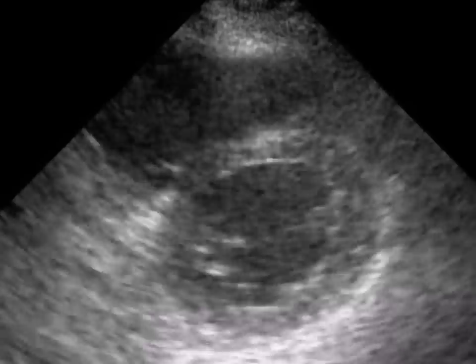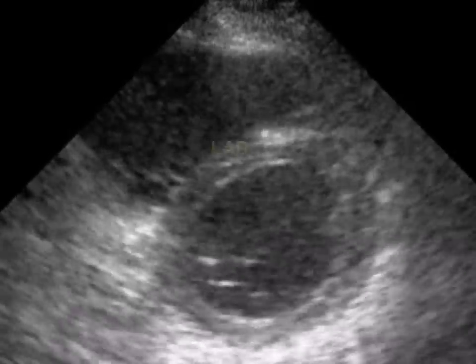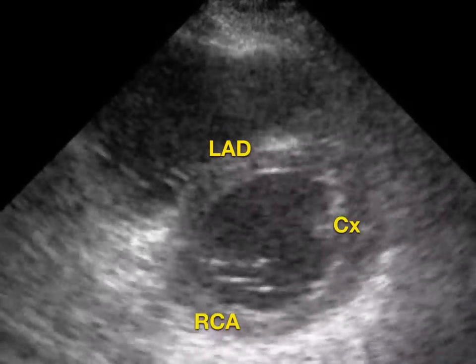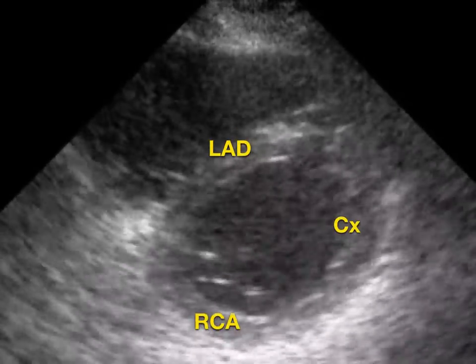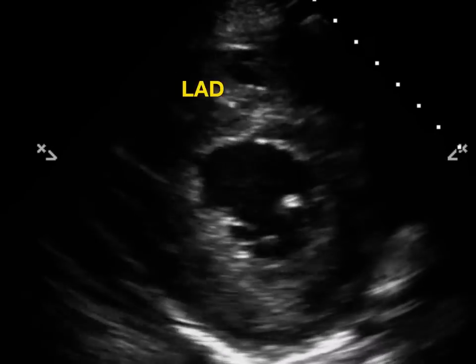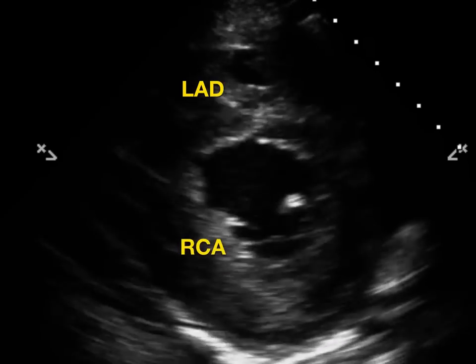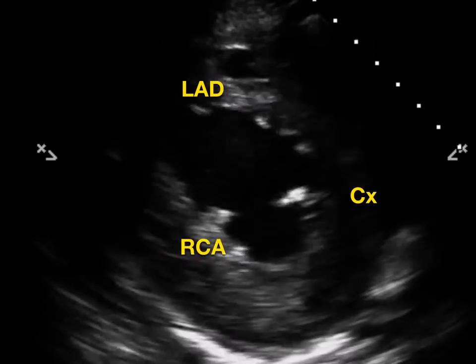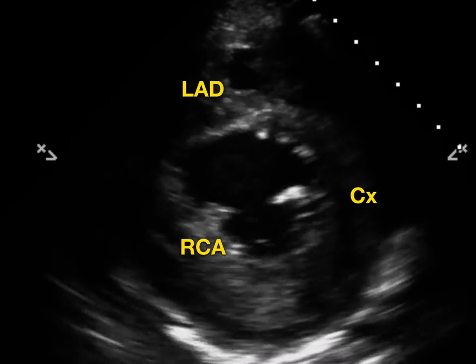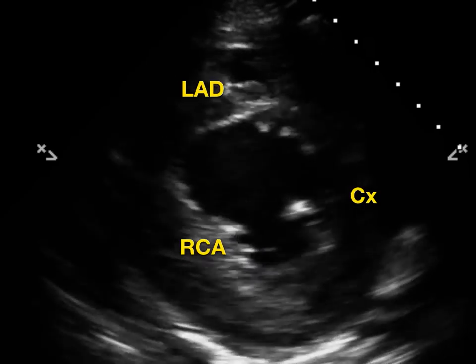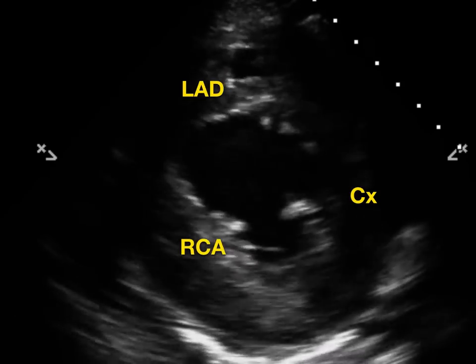Let's look at some examples. Get your bearings and see what you think — you've got the LAD, the RCA, and the circumflex. This first one is normal, no akinesis. Next, take a look at this one: the LAD area looks like it's moving pretty well, the RCA maybe not so much, and the circumflex maybe a little bit — but it's tough. I would have difficulty discerning for sure between RCA or circumflex. In a case like this, you'd certainly want to get more views to nail down where that regional wall motion abnormality is.